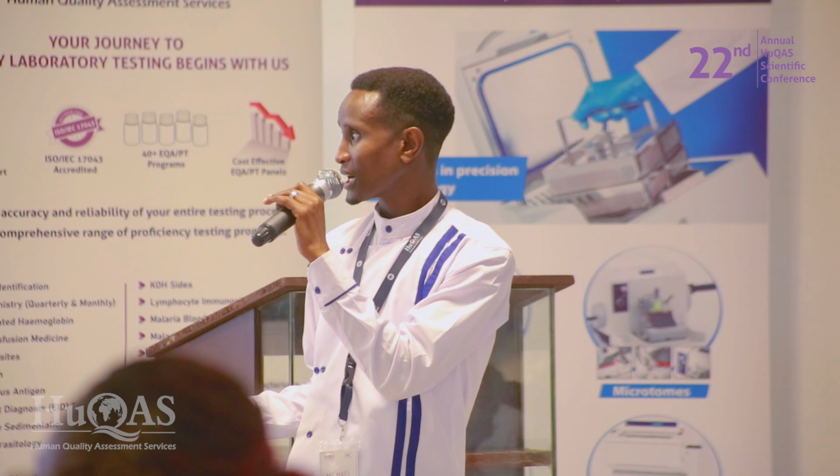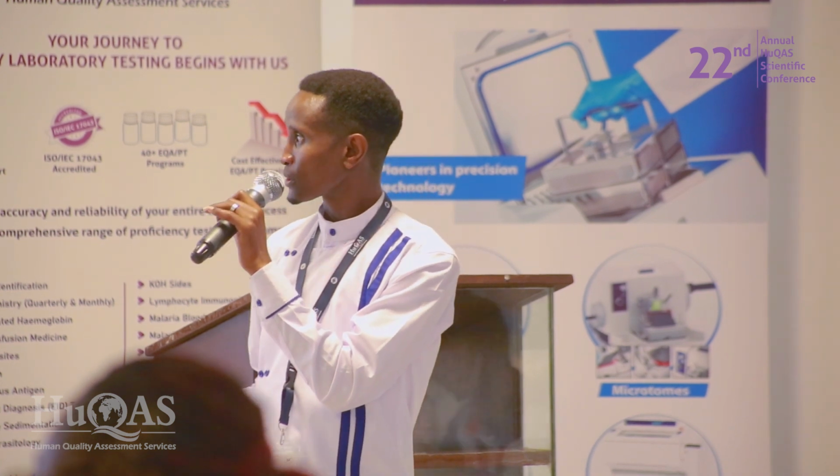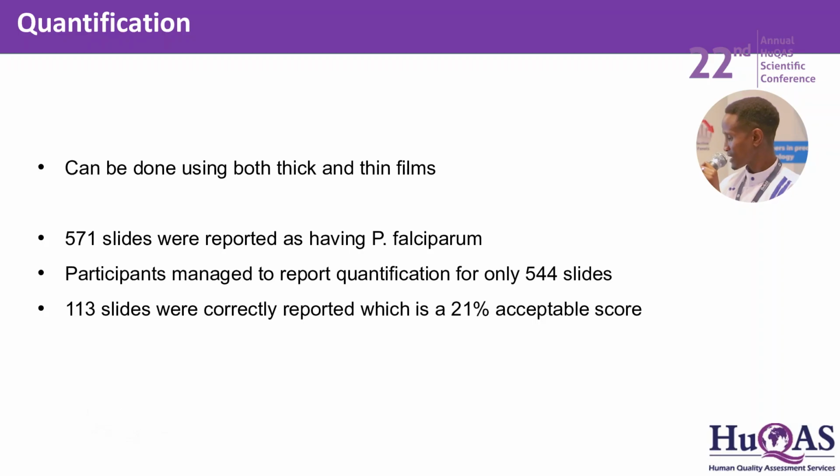For these, 571 slides were reported as having PF, but only 544 were able to be quantified by the participants. Of these, 113 were correctly reported in terms of the expected quantification values, which is a 21% score for the 3 years.